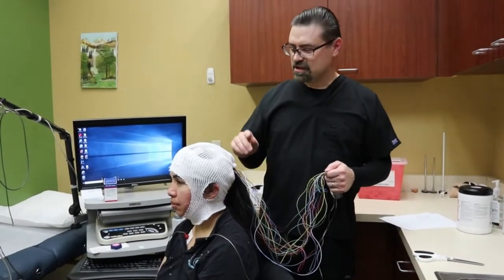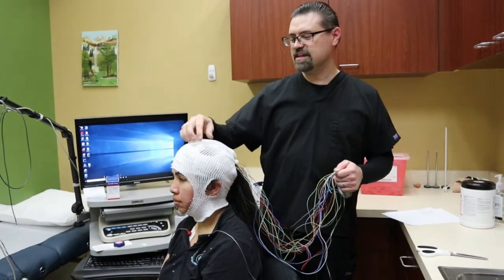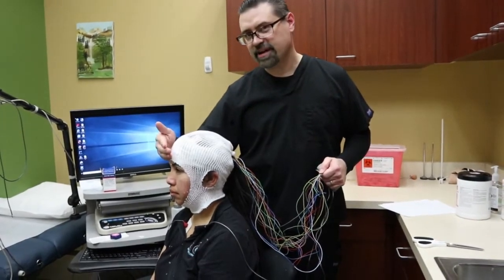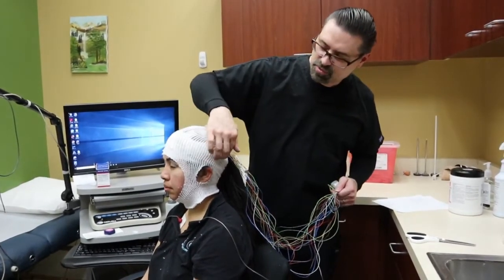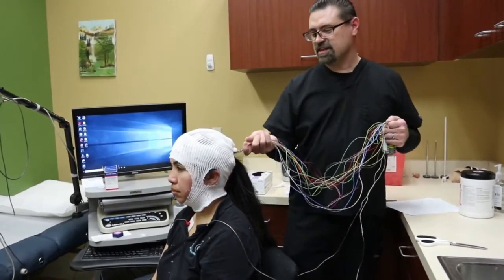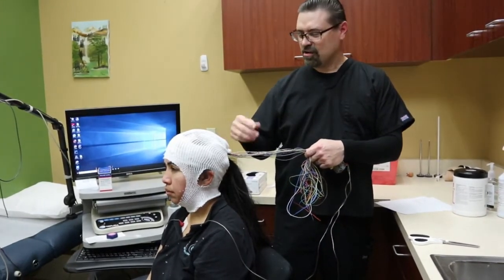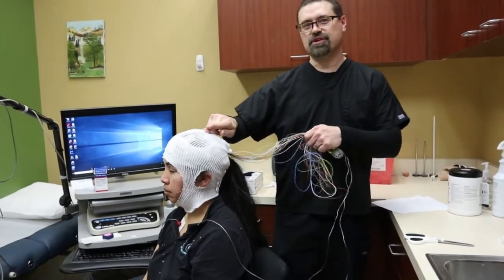The reason why this setup works is because the knot is in the back of the head. That means the tension is coming around the head instead of towards the top. If the knot's on the top of the head, the net's always going to want to pull towards the knot — the forehead is going to want to come back. Whereas with the knot in the back, it's pulling around and it's going to act more like a headband. The second reason it works well is because the wire braid is basically clamped between two knots. On top of that, it's got that little piece of tape around the wire braid that works as a brake — so I can pull on this all day long and no electrodes are going to move.